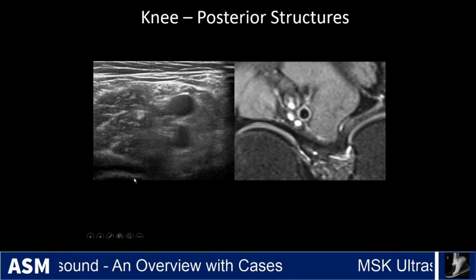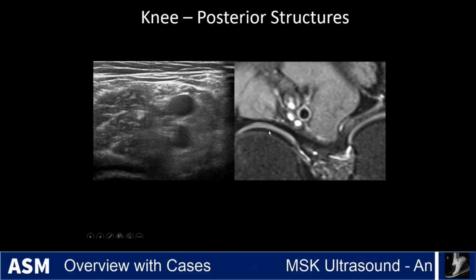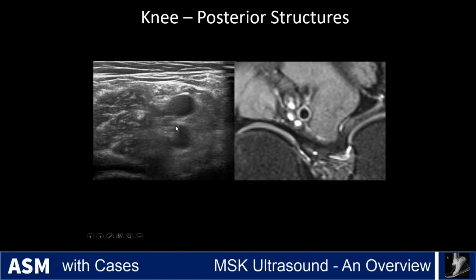If you look further down, depending on the depth that you set, you may see the back of the femoral condyle. So here you see the femoral condyle and some overlying cartilage or joint fluid sometimes back there.